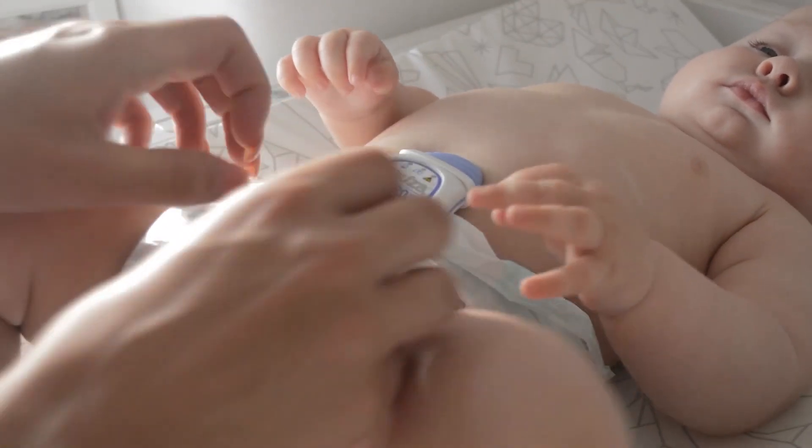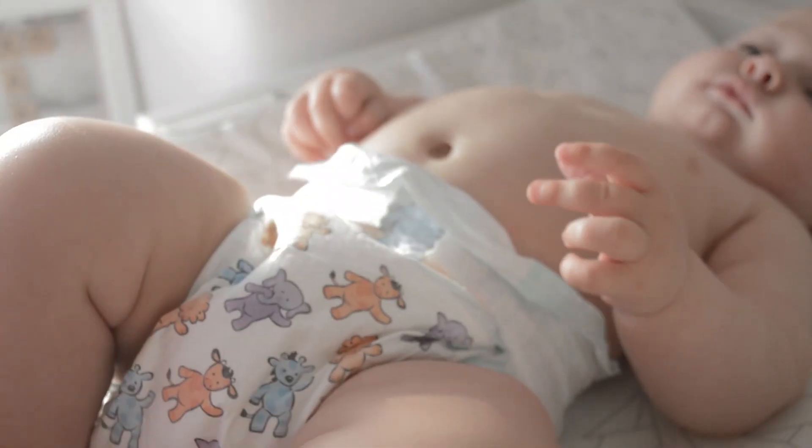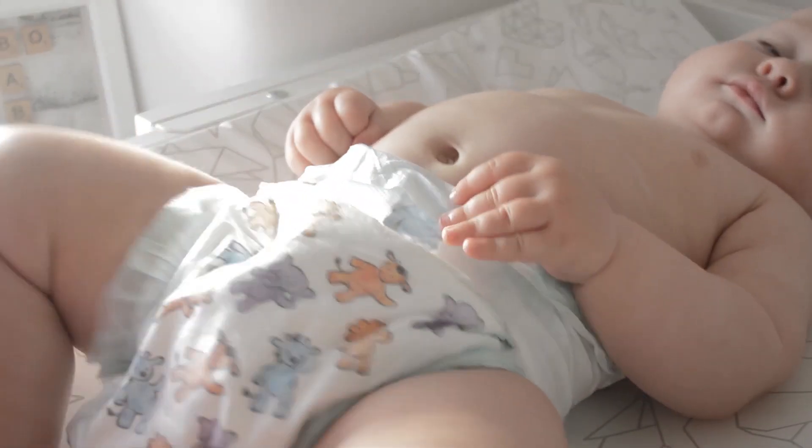I like to turn it off and put the leggings down. To turn it off, just press the buttons on both sides, slide off the nappy and put to one side. And that's it.